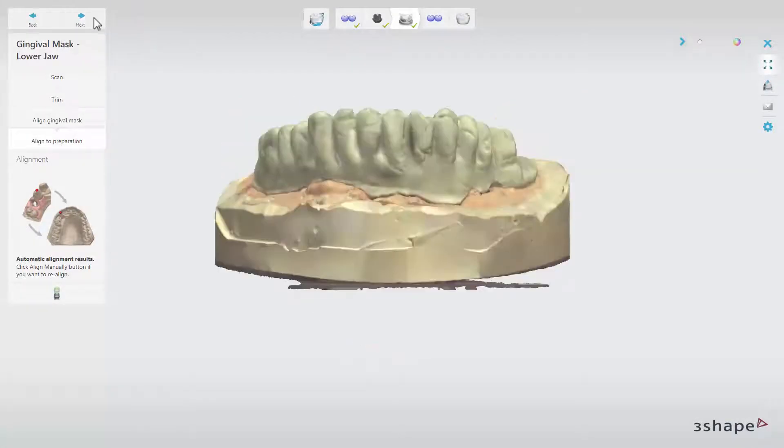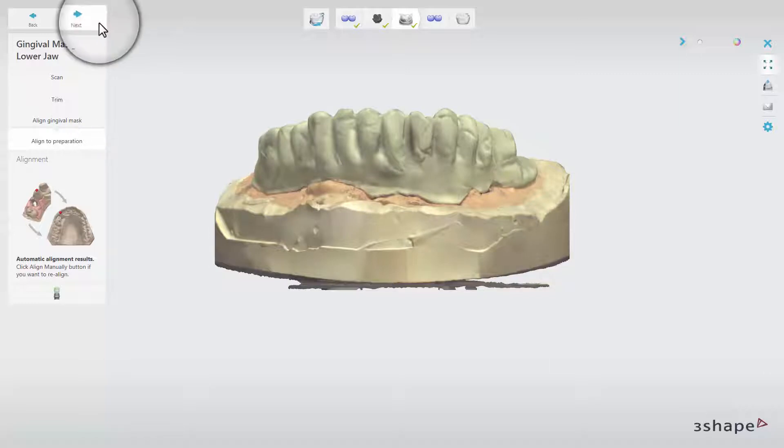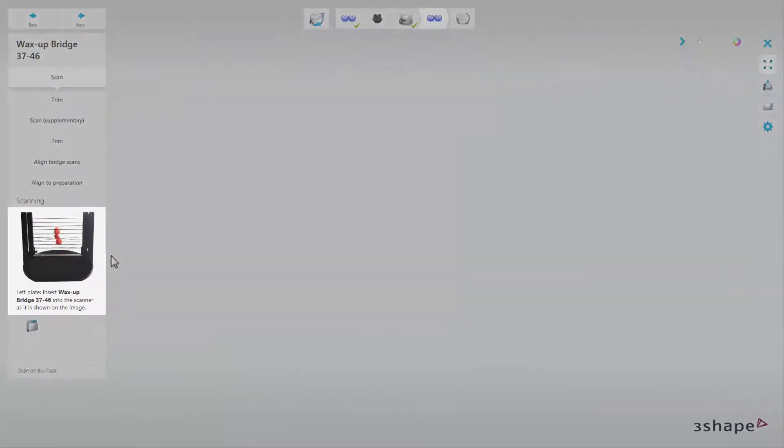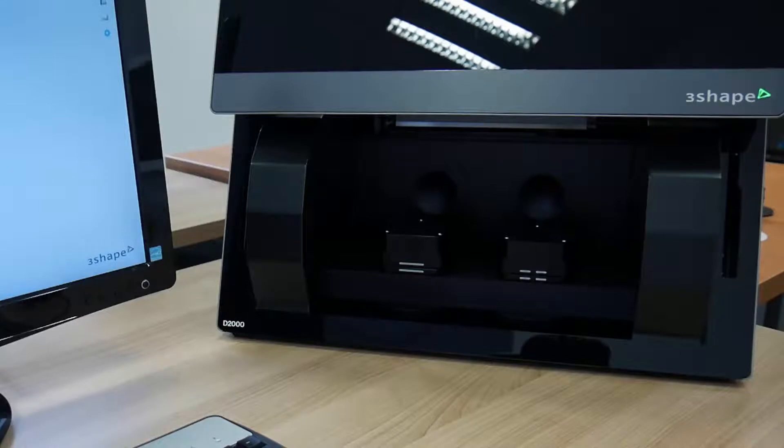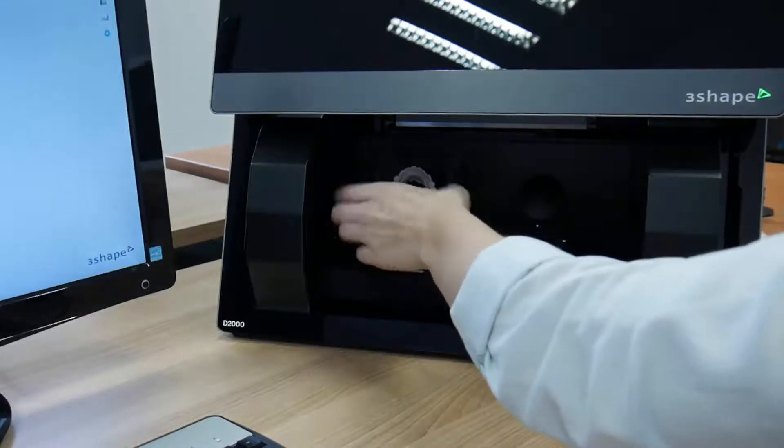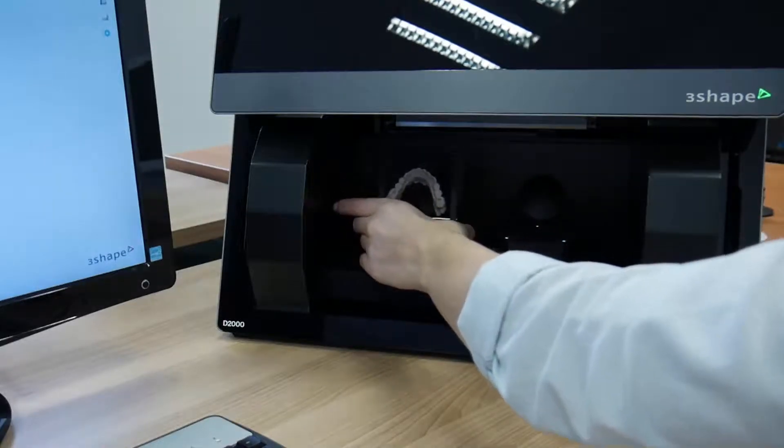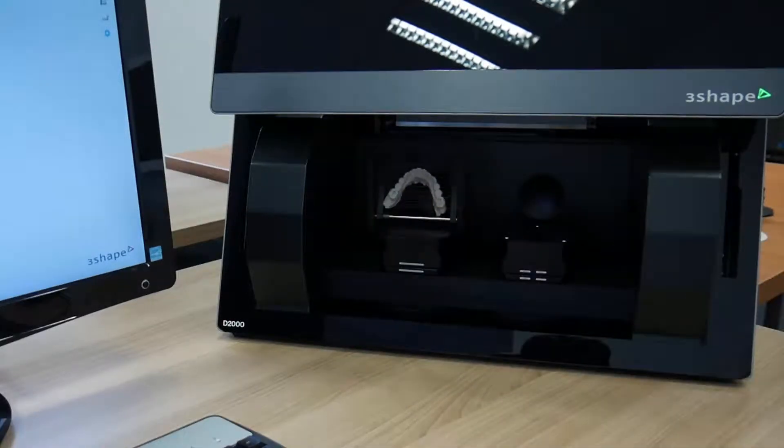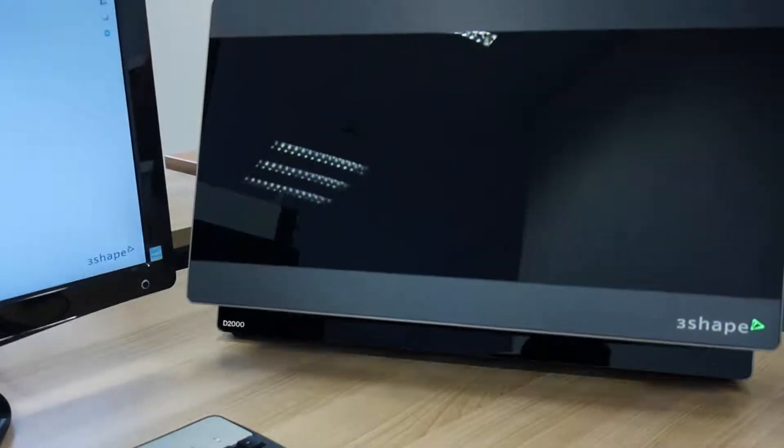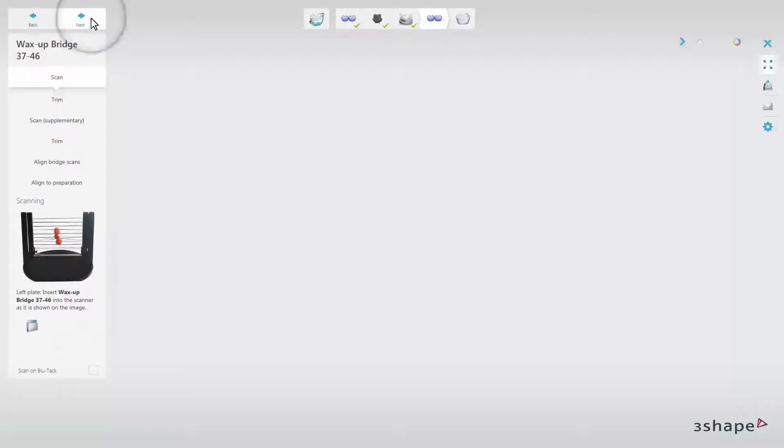You will move to the Align to Preparation sub-step. The procedure here is the same as in the previous sub-step. When ready, click Next. At this point, you need to insert the wax up into the scanner, as it is shown in the overview window. Close the door and click Next.